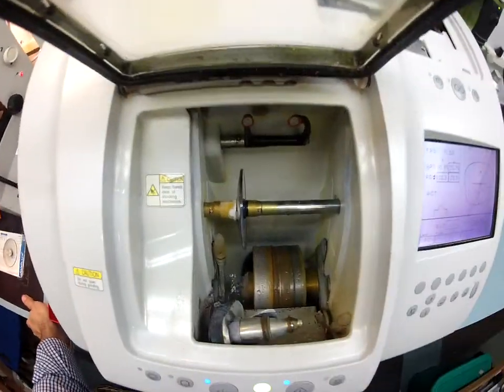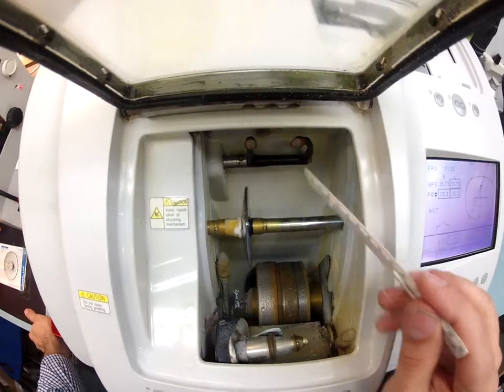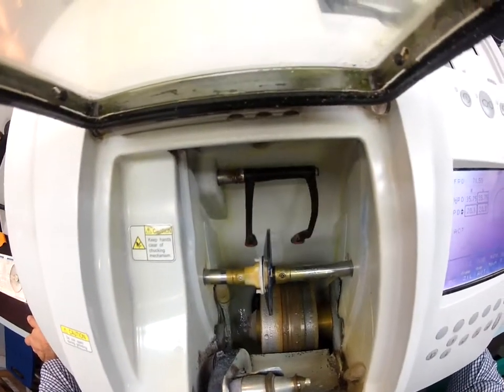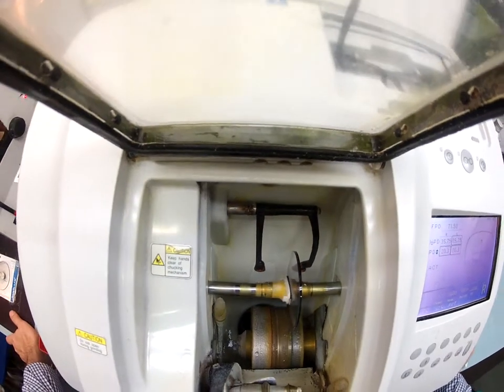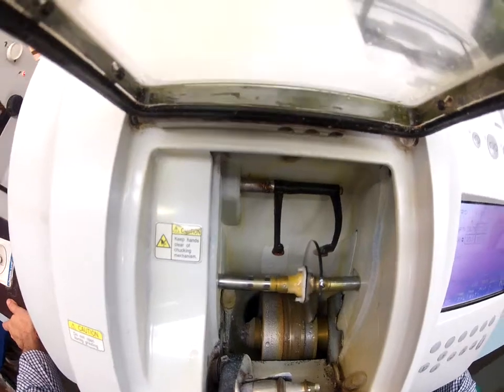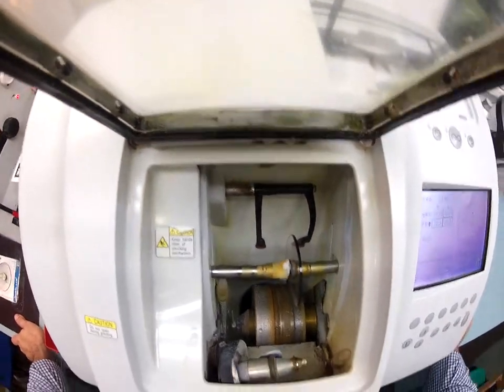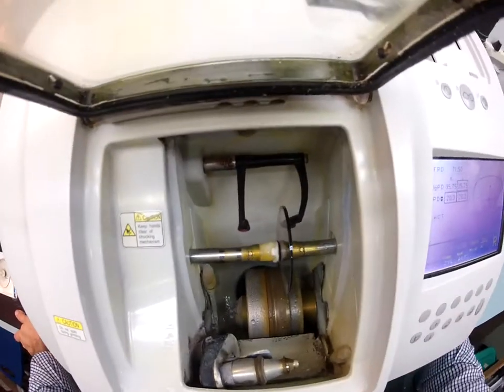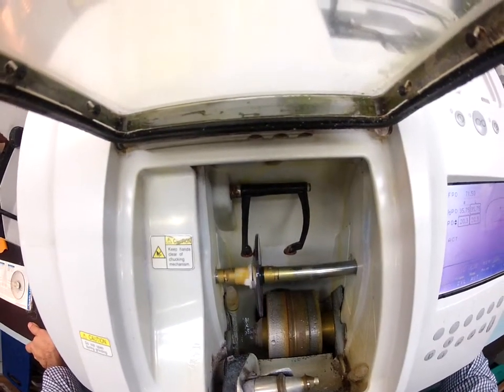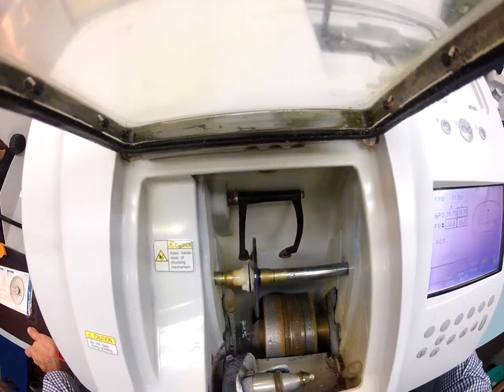Now, the first thing that's going to happen is the LMU is going to come down and trace the shape of your frame onto the lens. It's going to trace the concave side of the lens first, which is closest to your eyelashes. Then it's going to scoot over and trace the convex side of the lens, which is away from the face, using the calipers to measure the thickness of the lens, to know exactly where to put the bevel onto the lens so it stays inside the bevel of the frame.